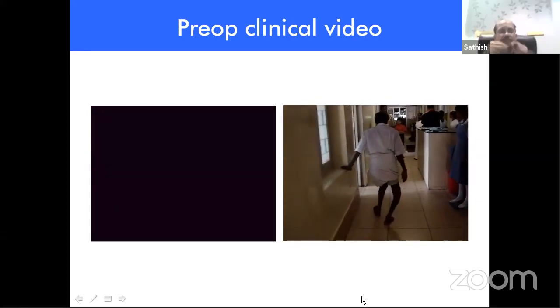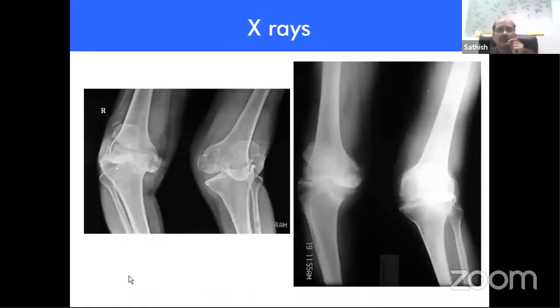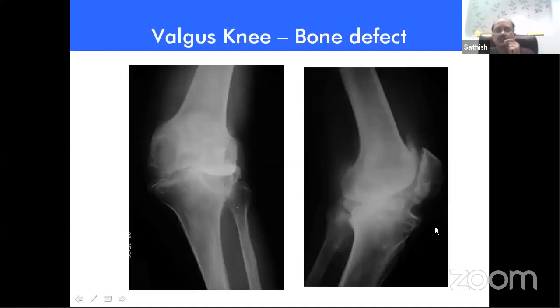But despite this deformity, I think he was able to walk. This X-ray was just taken in standing posture, and this is the X-ray after giving some traction. Obviously, a lot of instability is there. With traction, a lot of the deformity is corrected. Also, we can see both on the medial side and the lateral side there is a defect in the tibia, a medial defect on the varus side and a lateral defect on the valgus side. A closer view shows a very clear defect.